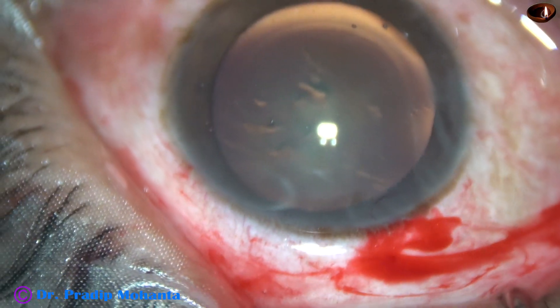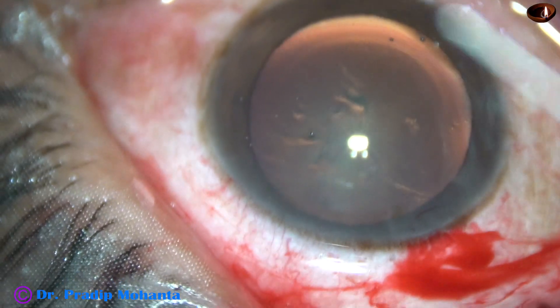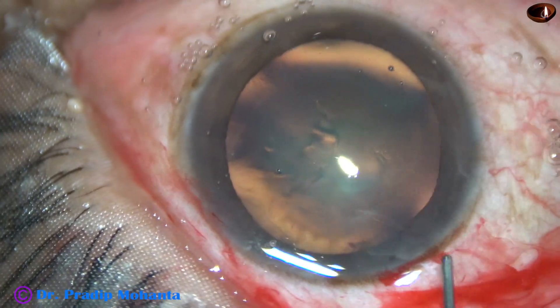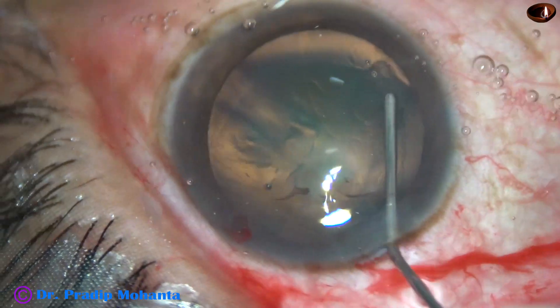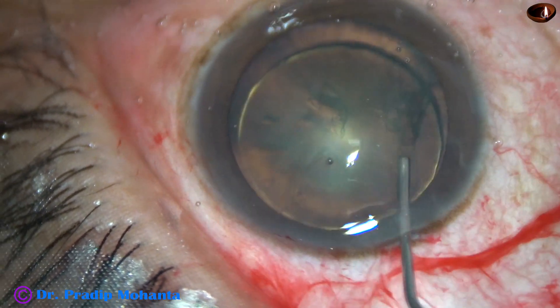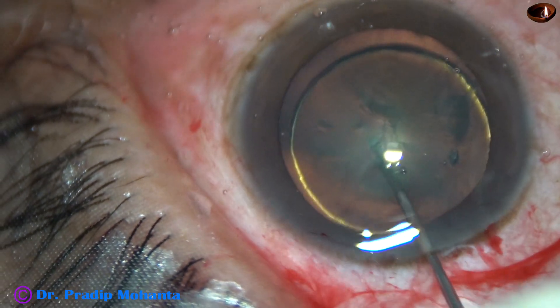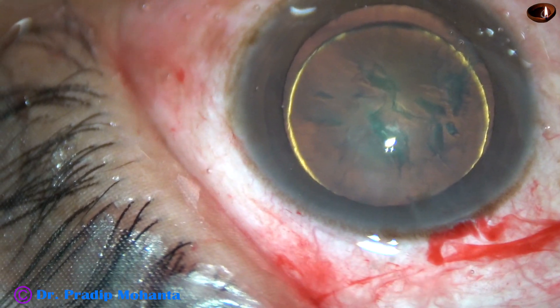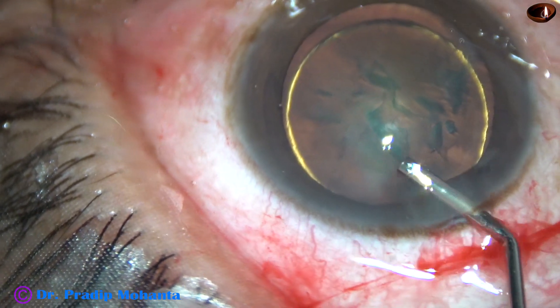Probably we can complete the case and proceed with FACO, because the nucleus is soft. We don't have to exert a lot of pressure on the posterior capsule to manage this. In a minute or so, this nucleus can be managed.